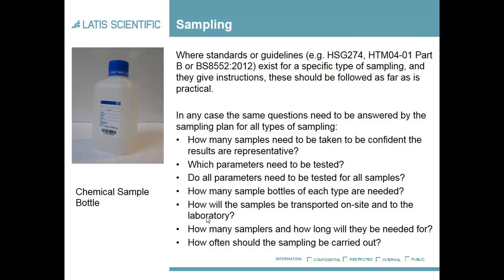A is design and commissioning. B is operational management, which is where we'll find the majority of the information on sampling. And obviously part C as well is Pseudomonas aeruginosa specific for augmented care. Now that's obviously for nosocomial, so hospital environments. A lot of the information there is similar to that in the HSG documents, but there is a little bit of additional information, and especially with regards to Pseudomonas aeruginosa, which isn't covered in obviously the HSG.